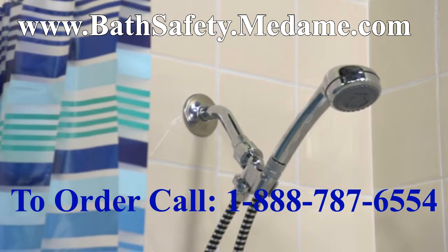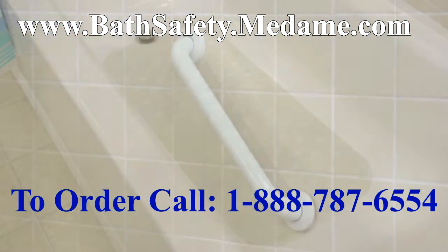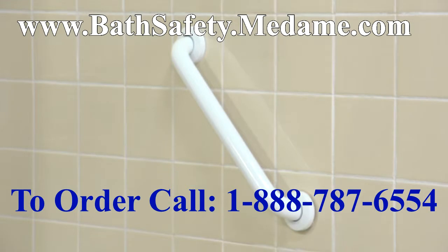When using a shower chair, consider adding a shower sprayer, bath mat, and grab bar for additional safety in the bathroom.